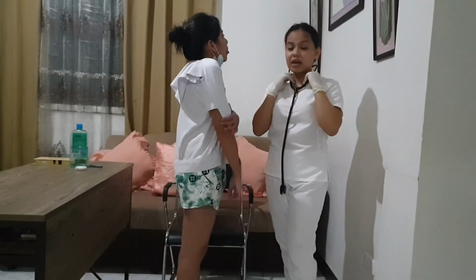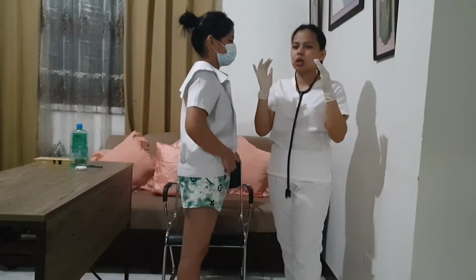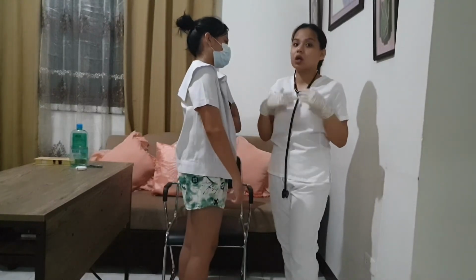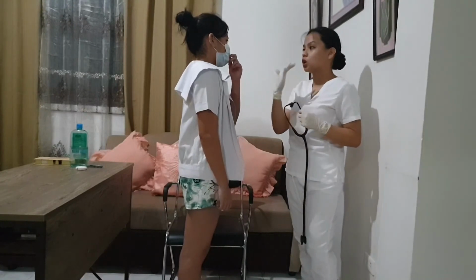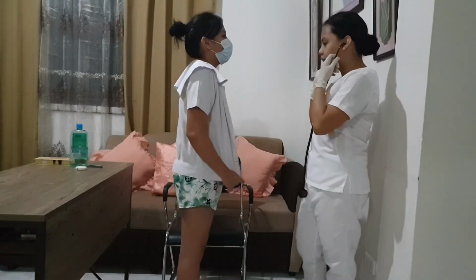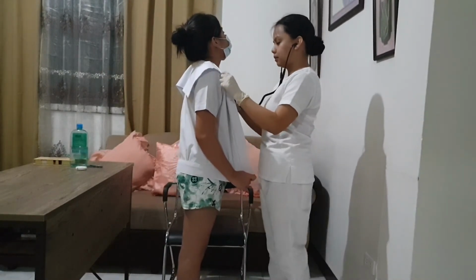Okay. So I am done with that, but I am going to repeat the procedure so that I will be sure and I can be more focused on the sounds that I'm going to hear. Okay, so I'm going to do the procedure, ma'am, and it's important that you breathe through your mouth again. It's okay if you use your mask. Okay, just breathe through your mouth. Okay, I'm doing it.